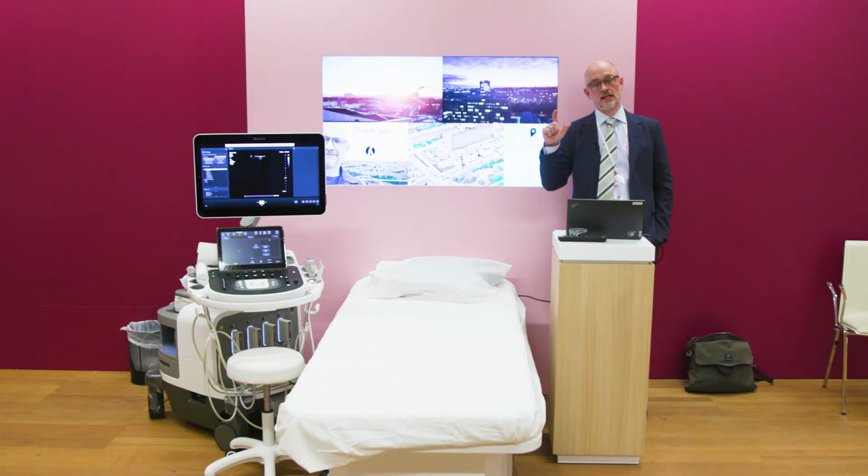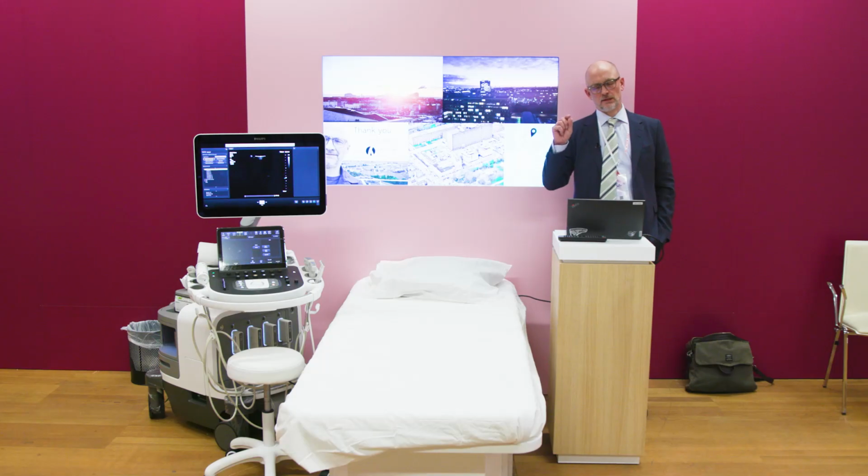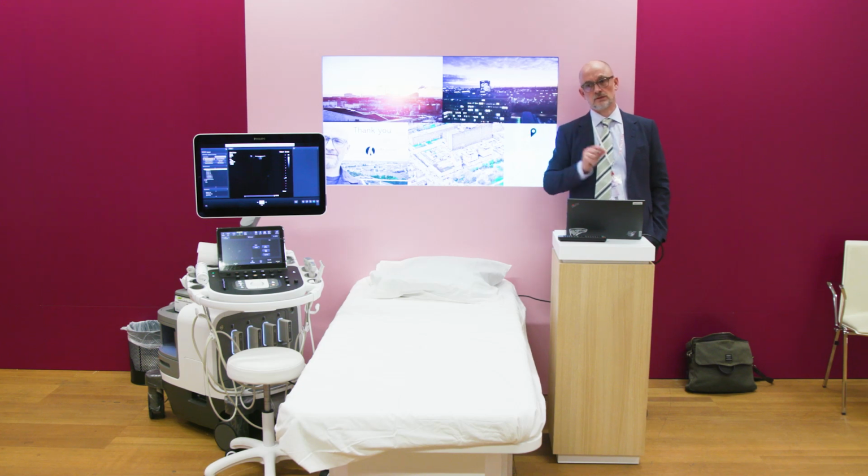So it surely works on the tricky cases as well, and it has this standardized way to place the calipers, so you don't need to use a lot of time to do that. As far as I understand it, they calculate the difference between the pixels, so it's not a discussion if it should be here or there.